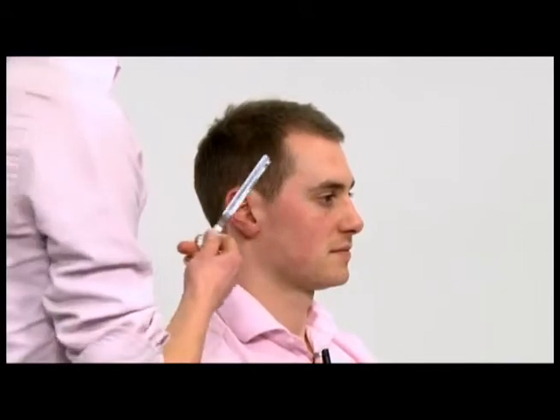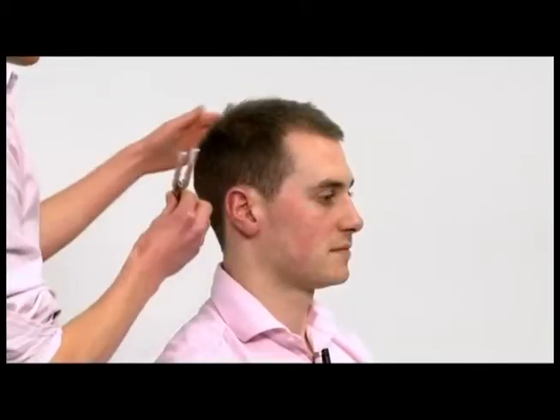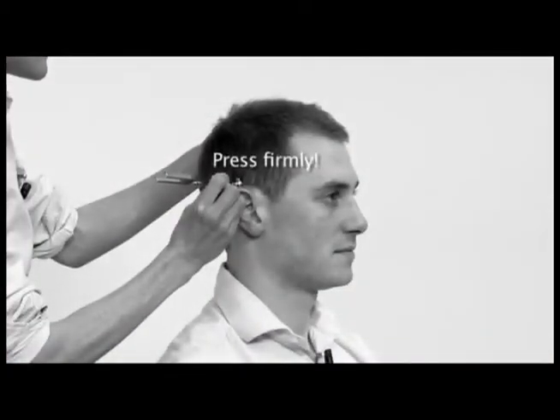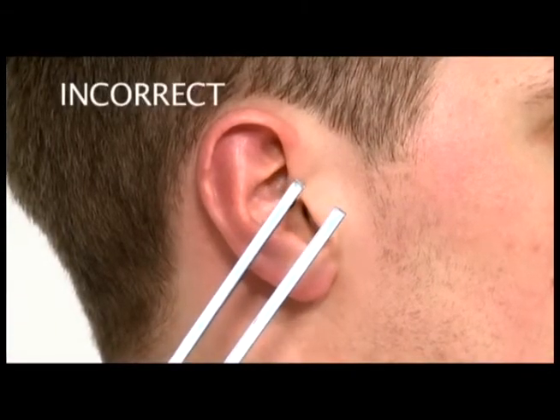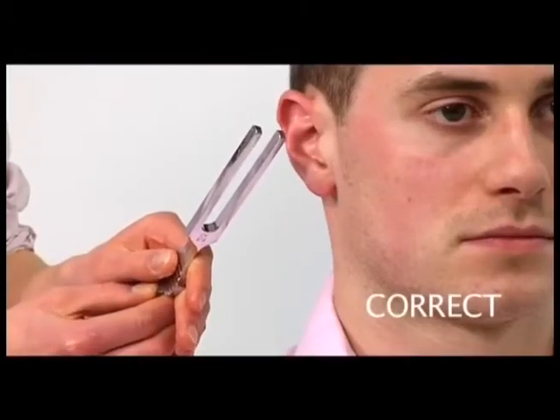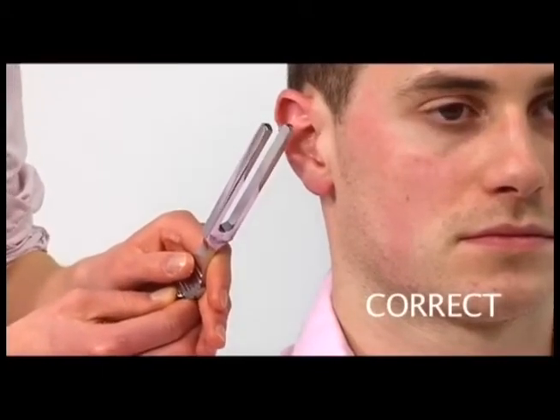So you're going to hear a buzzing. I want you to tell me which position it is louder in. So position A, this tests air conduction, or position B. Bone conduction is tested by placing the base of the tuning fork on any bony area surrounding the ear. When testing air conduction, the tines of the tuning fork should not be held parallel to the external auditory meatus. Instead, they should be held perpendicular to the external auditory meatus and about 1 centimetre from it.